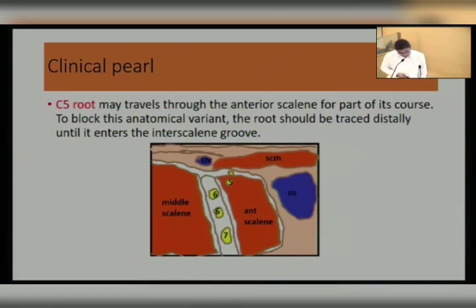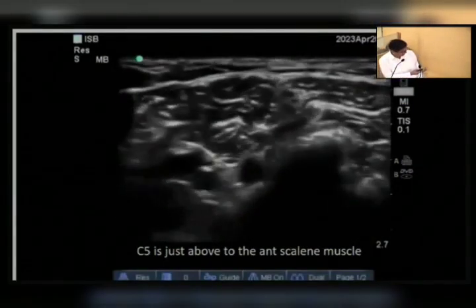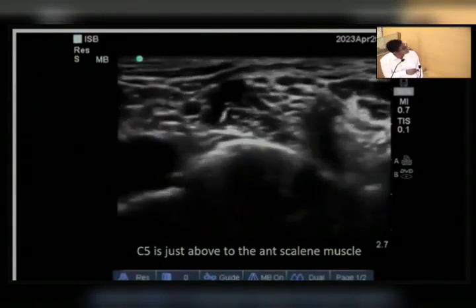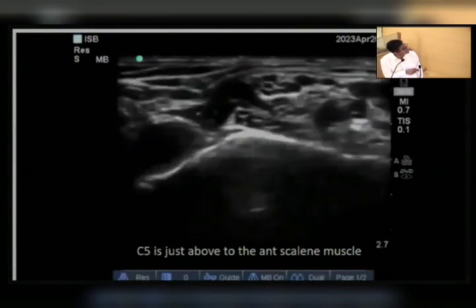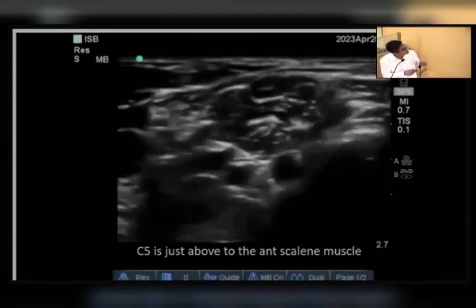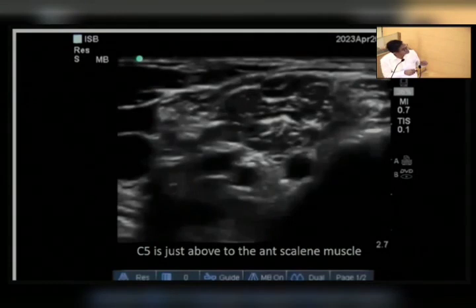One more thing is that the C5 root may be present in the anterior scalene muscle. See, in one of my videos you will find this is the anterior scalene, the neural element, it will mix with C6 and they form the superior trunk. When we go from interscalene to the supraclavicular region, see this is C5 which meets with this C6 and they form the superior trunk over here. So this is one of the abnormalities, like the C5 root may be present in the anterior scalene, so that can be a reason for your block failure if you can't scan properly.